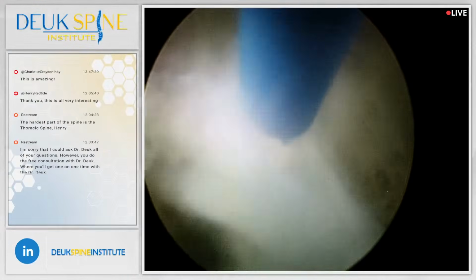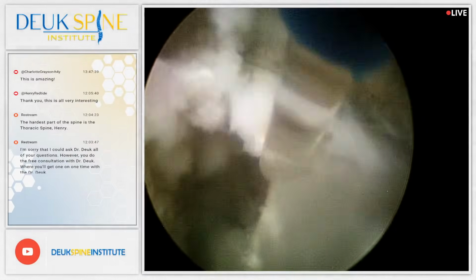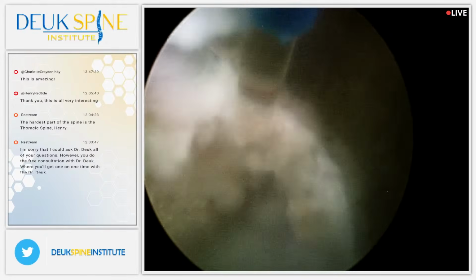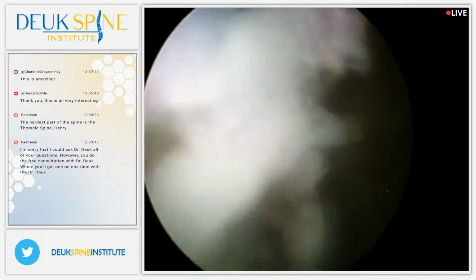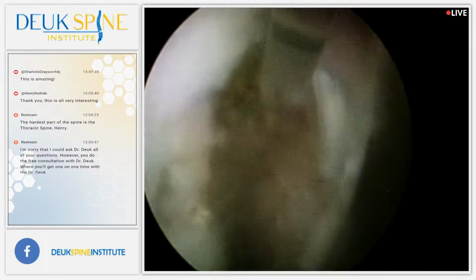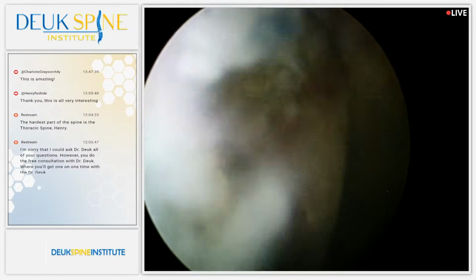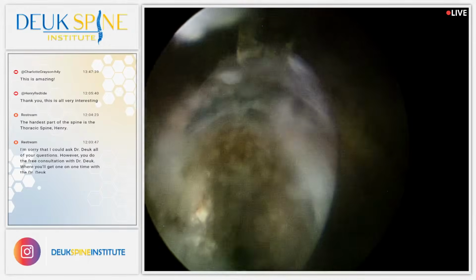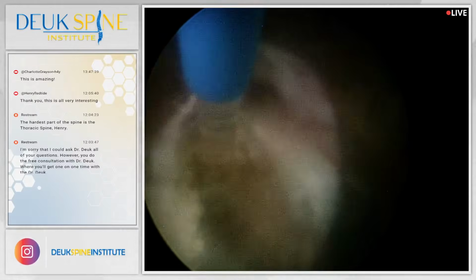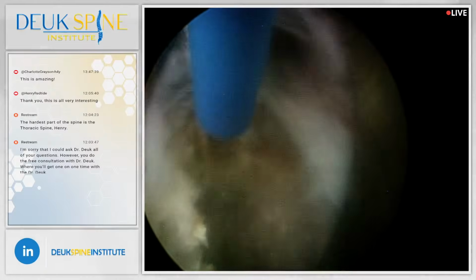Welcome back. We're just finishing up L5-S1 laser spine surgery. The laser fiber is at 12 o'clock. You can see it. It looks like a glass fiber. We use it to remove the herniation. We use it to remove the scar tissue and inflammatory tissue that's down here around the disc. This stuff here is all herniation. This is where her pain is coming from. And we've done a good job of cleaning it out.